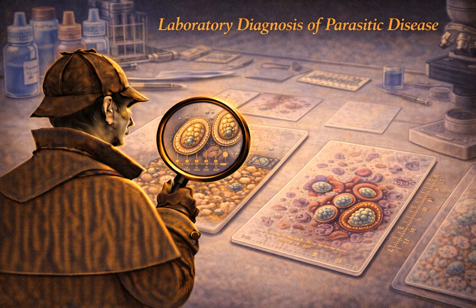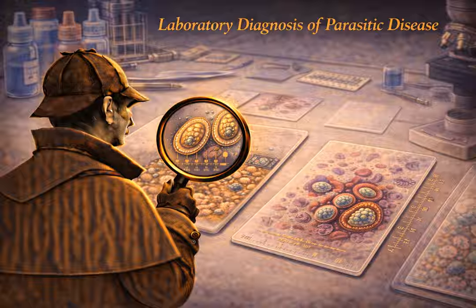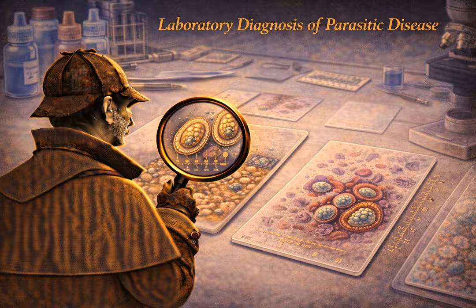Yeah, I've seen this exact order set in the hospital computer systems. Stool O&P times 3. Why 3? Is the test itself really that bad? Why can't we just get it right the first time we look? It's not that the microscopy is bad, it's that the parasites themselves are incredibly inconsistent. They shed intermittently. They are not at all like bacteria, which are just constantly dividing and always present in the gut lumen. Parasites release their eggs or their cysts in bursts or cycles.